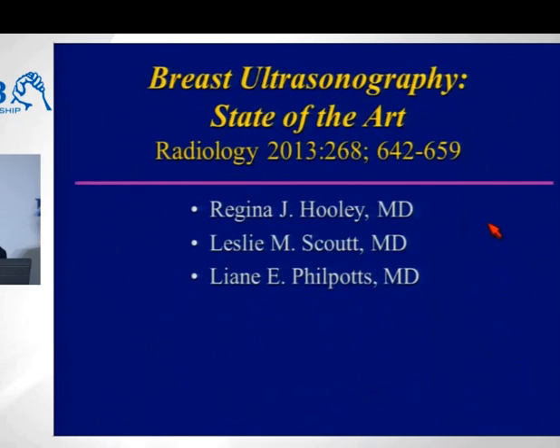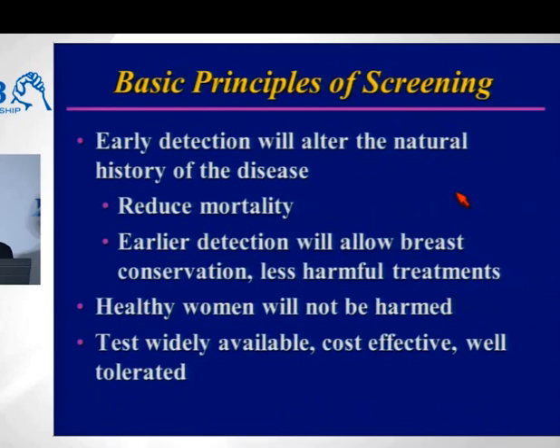But what I wanted to do is bring your attention to this wonderful article earlier this year, which goes over all the basics of ultrasound, this year's radiology, and this is the group from Yale. It's a wonderful article, so I'm not going to spend a lot of time on the basics. What I wanted to start focusing on, though, is using ultrasound as a screening tool.